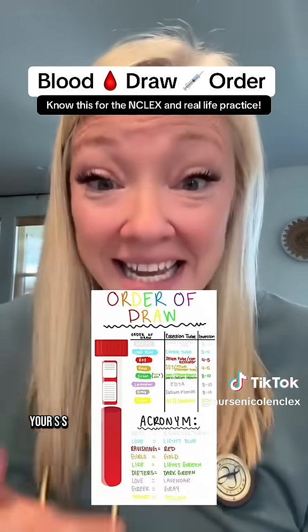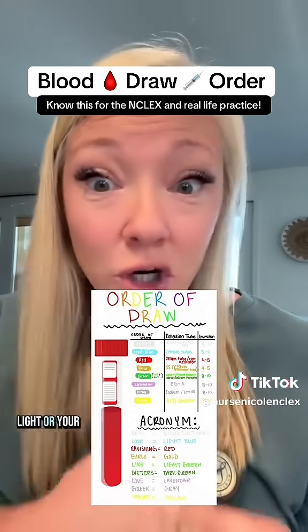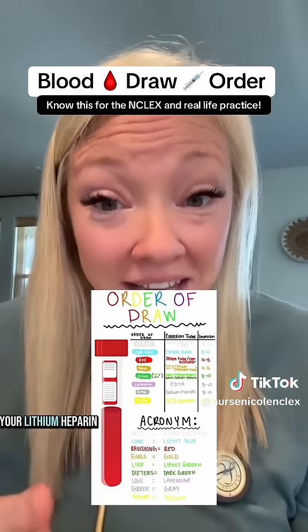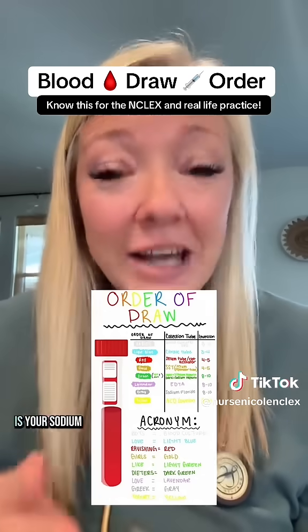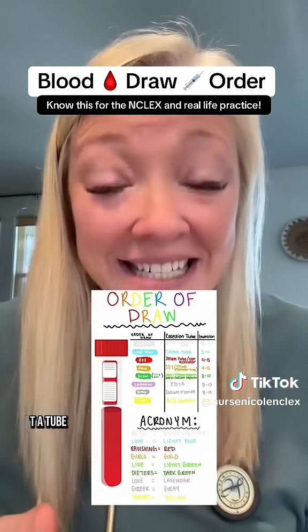Then you have gold, which is your SST or serum separator tube. You have green, which comes in light or dark — the light is your lithium heparin and the dark is your sodium heparin. This is followed by lavender, which is your EDTA tube.